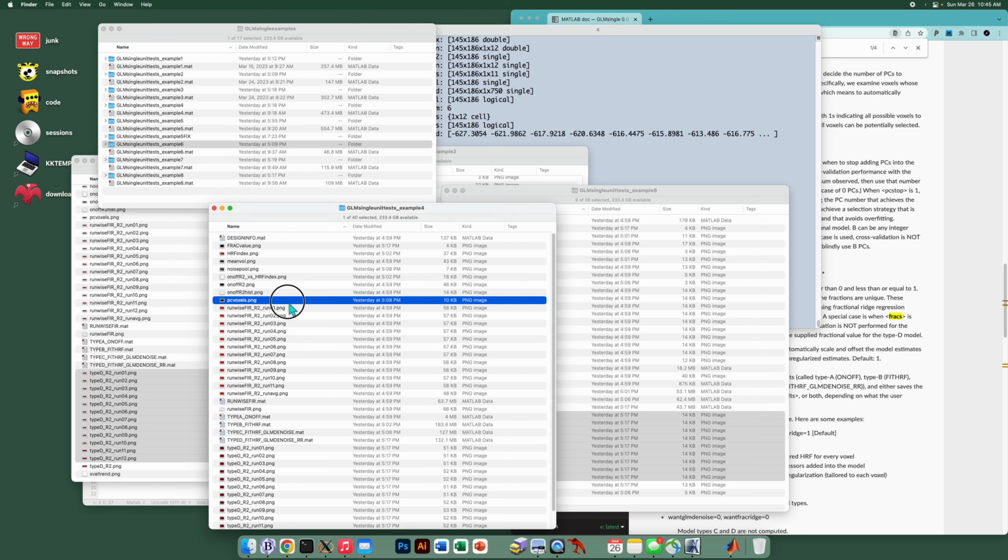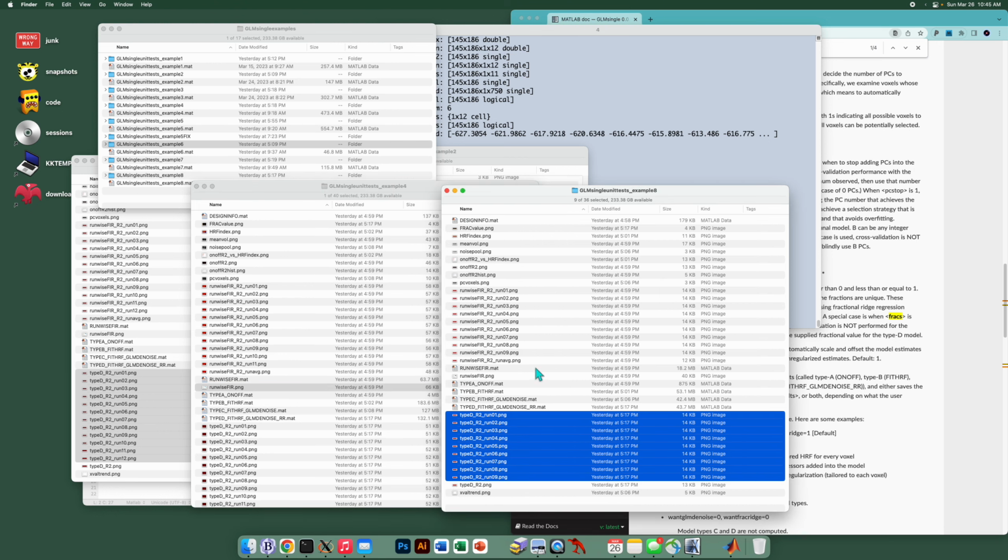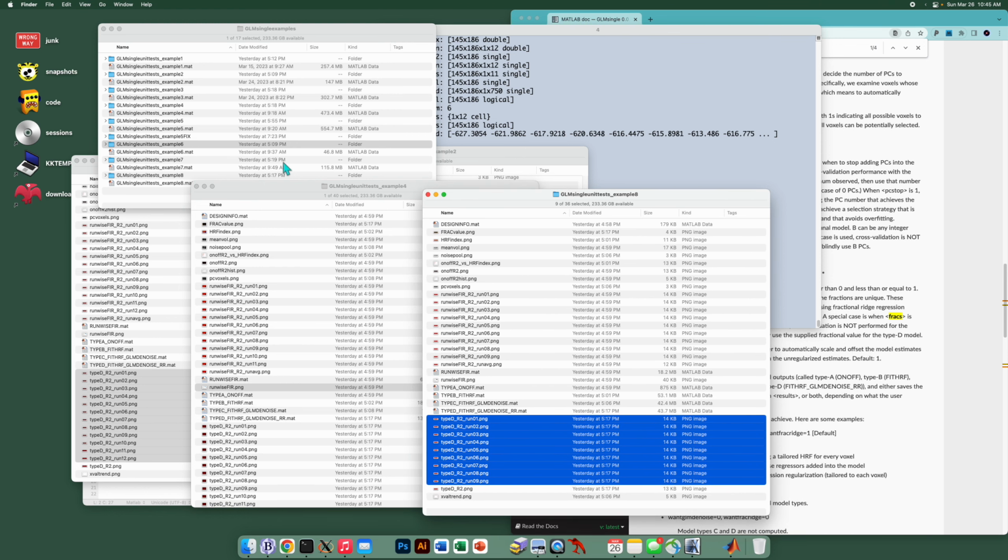It takes a little while to get used to what we're staring at and to interpret any given session, but it's especially these figures, the FIR figures, that are very useful if you notice any data set that doesn't look quite good. It can help you diagnose what's going on. And especially if you have many subjects or many sessions on the same experiment, it's very useful to do a direct comparison of how these figures look across those instances.